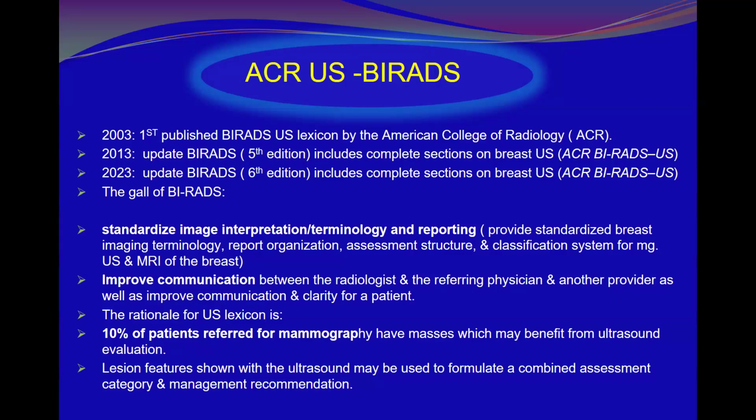In 1993, the Breast Imaging Reporting and Data System was developed by the American College of Radiology, ACR, to standardize the language for reporting mammography and to facilitate communication between clinicians by clarifying mammographic interpretations. The ACR later developed a BI-RADS lexicon for ultrasound, and the first edition was published in 2003.